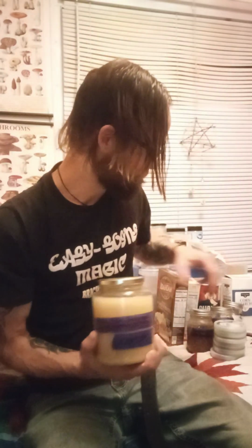If you really want to train it completely to straw, I wouldn't have put as much of the other stuff, and I would have done more of the straw water and used like 30 milliliters in a 500 milliliter batch. But I just want to introduce it. I'm going to train a couple cultures to this specifically, and I'm going to grow them on straw.